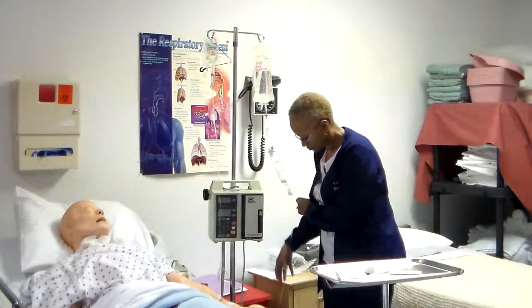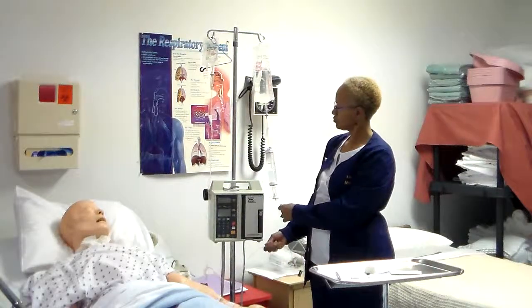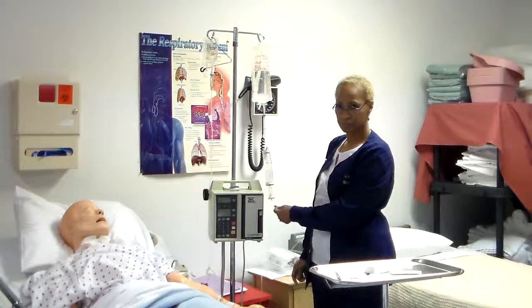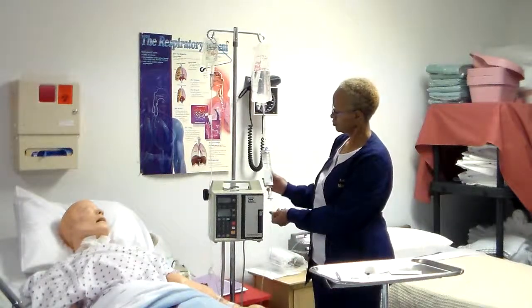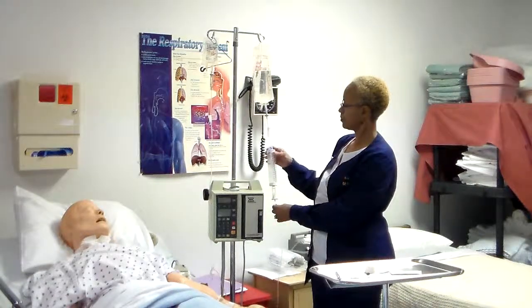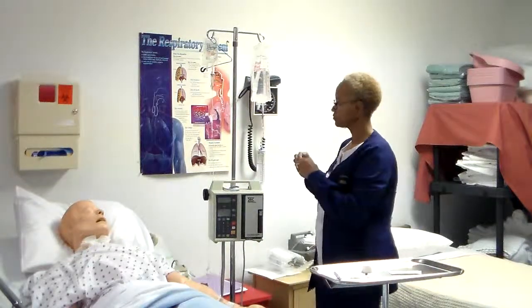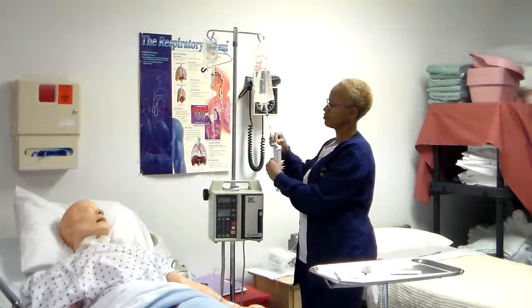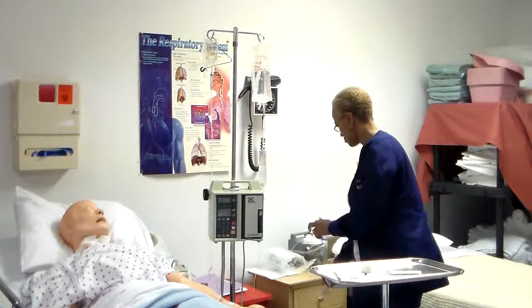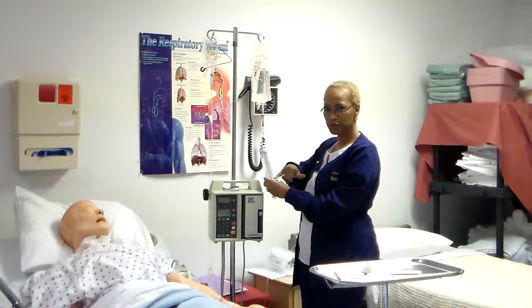Fill Volutrol with desired amount of fluid, 50 to 100 milliliters, by opening clamp between Volutrol and main IV bag. So you clamp here. Close clamp and check to be sure clamp on air vent of Volutrol chamber is open. Okay. Clean injection port on top of Volutrol with antiseptic swab. While we clean here. Remove needle cap or sheath and insert syringe needle through port, then inject medication. And I will put my medication directly in here, and it will be in this amount of fluid.